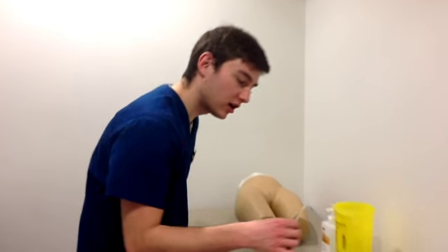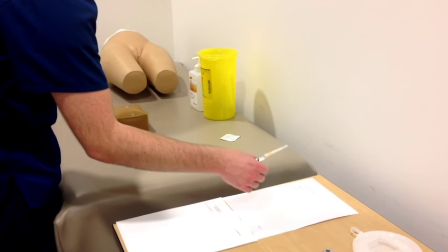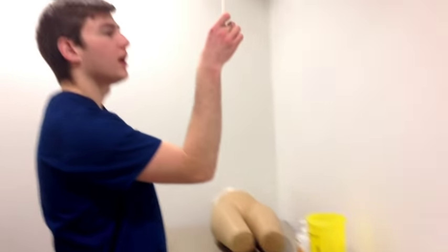Alright, so for the injection for Mr. Massini, I'm just going to check the medication one last time against the MAR. So here we're doing heparin. I'm supposed to have 1 milliliter, and I have 1 milliliter in my syringe. So I'm ready for injecting.